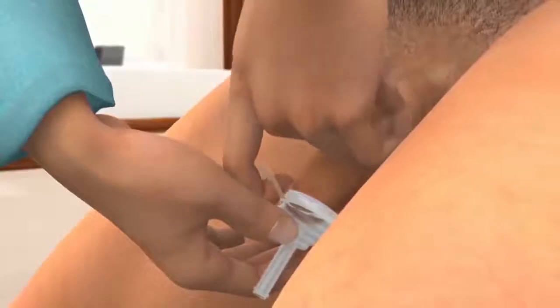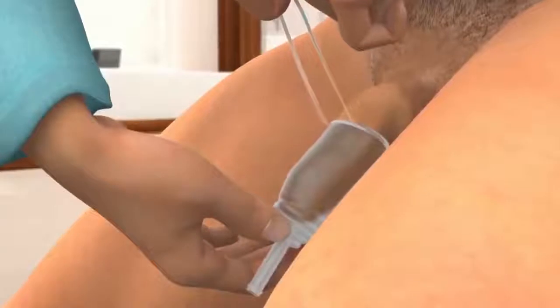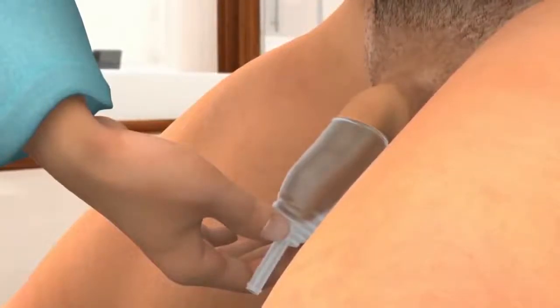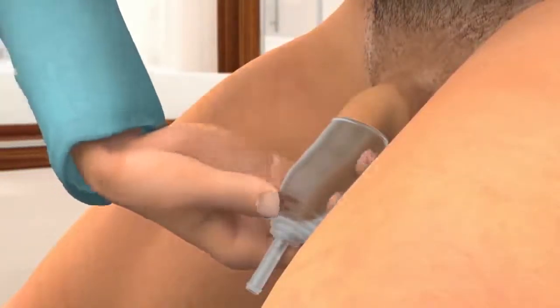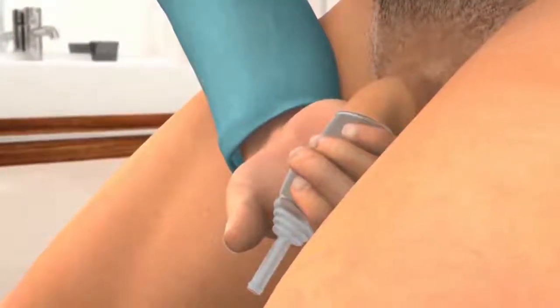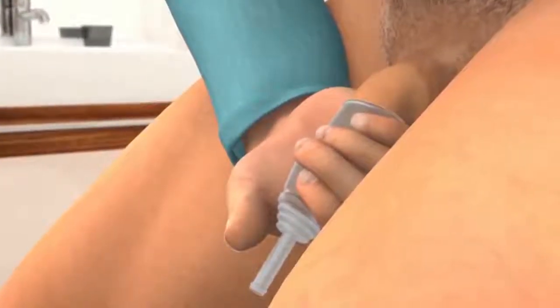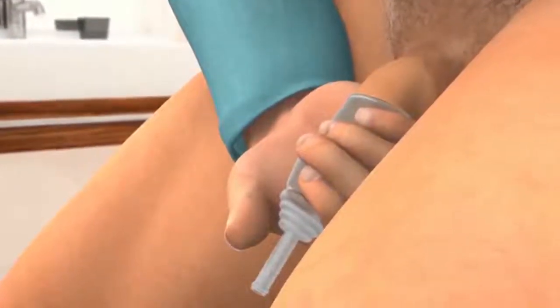Holding the Urosheath in place with one hand, use the other to slowly pull the loop of the strip towards yourself. Unroll the Urosheath completely. Gently squeeze the unrolled Urosheath around the shaft of the penis to ensure a secure fix. Conveen Optima comes with the adhesive already on it, so no additional adhesive is needed. The Urosheath is now in place.